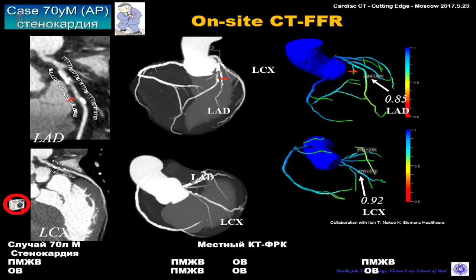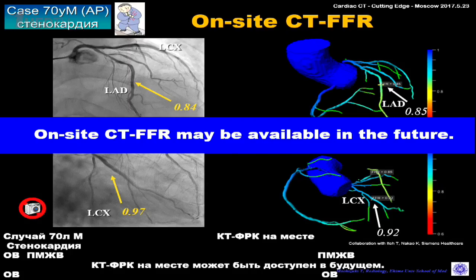And there are some trials by the CT vendors and workstation companies to measure the CT-FFR on-site. So on-site CT-FFR may be available in the near future.